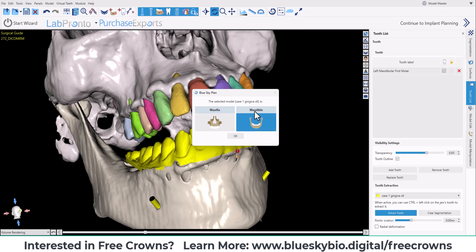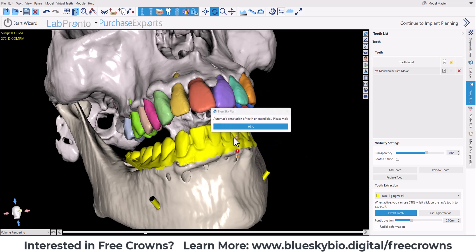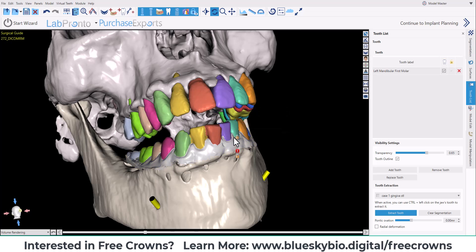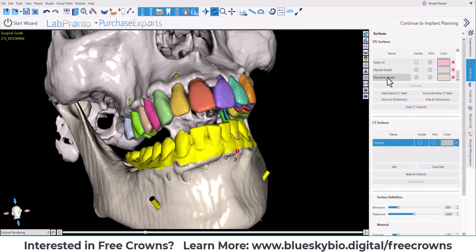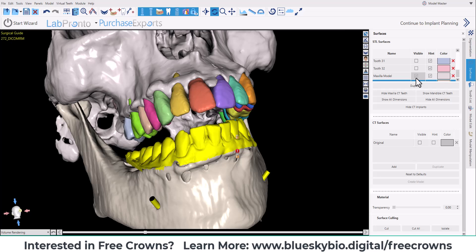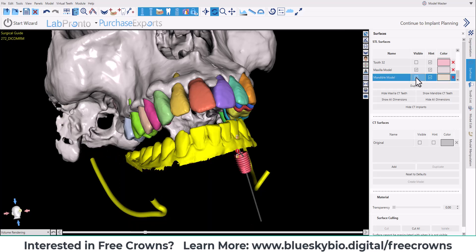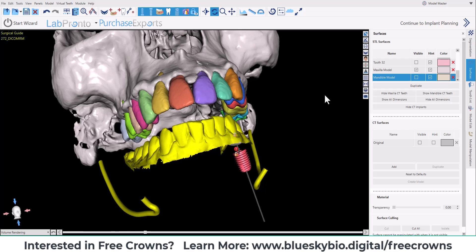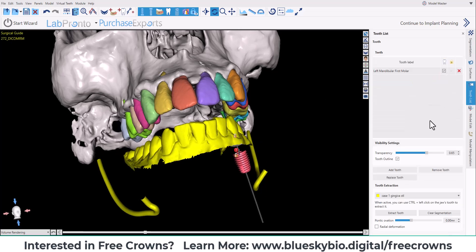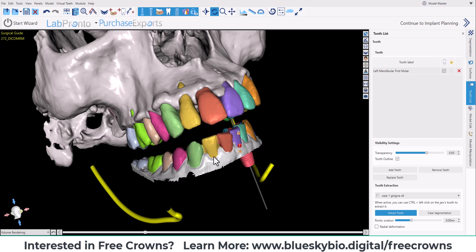The software confirms the model type and runs an annotation. We can see that the teeth have been segmented — this is the segmentation from the optical model scan. I'm going to hide the mandible model. Now going back to extract tooth, we can see that the crowns have been segmented.